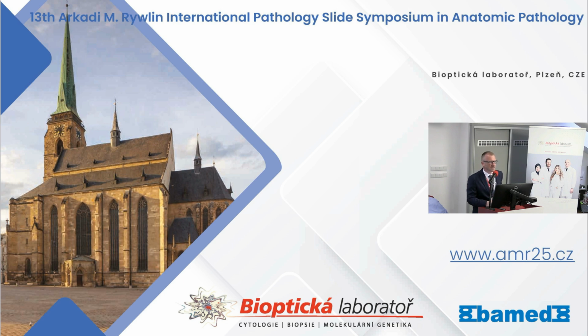No. So the training of the AI, it doesn't think. It can't imagine that, yeah, these are small blue cells, I have to think about small cell carcinoma. Yeah, there is some crush artifact and so on, no cytoplasm. All you can get is, yeah, carcinoma, nothing more.